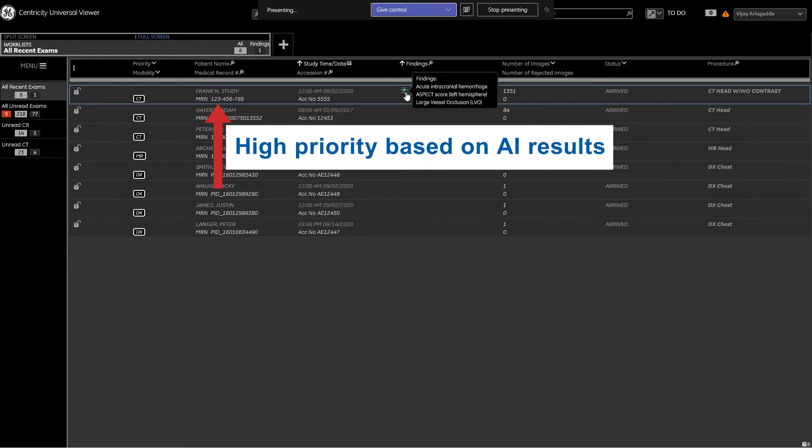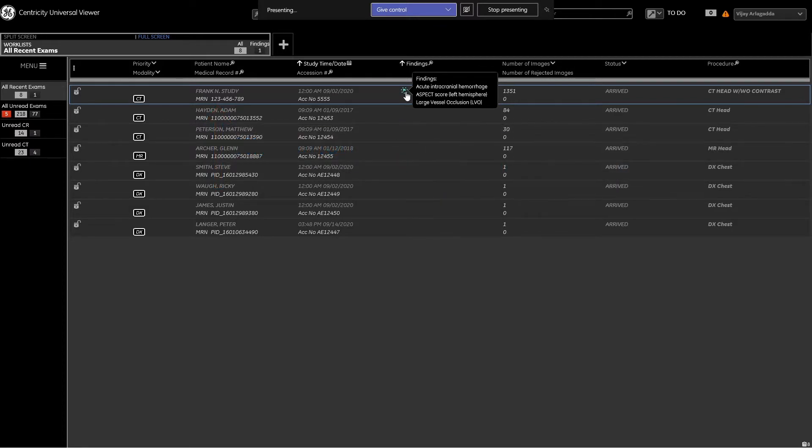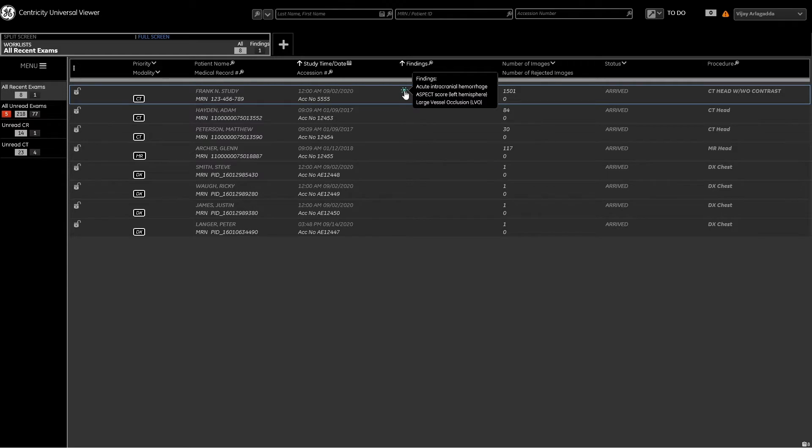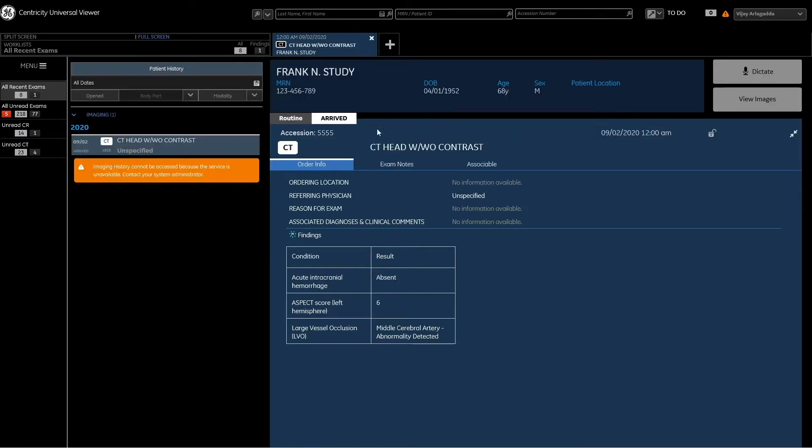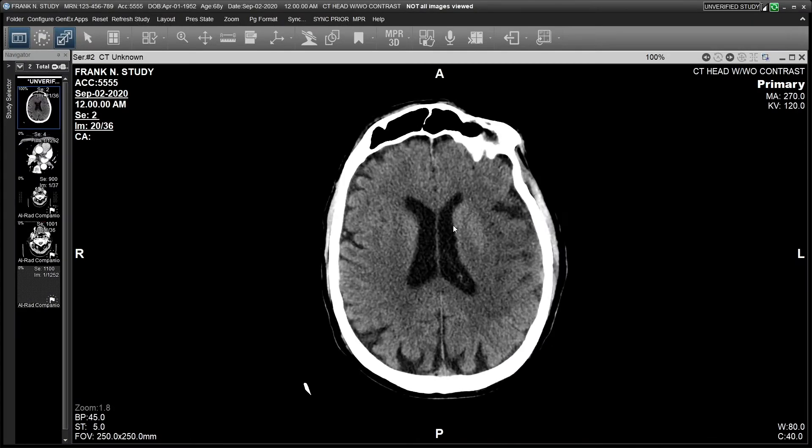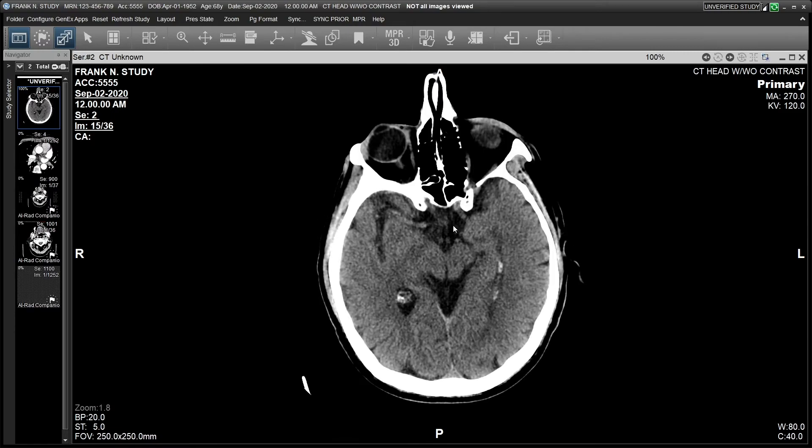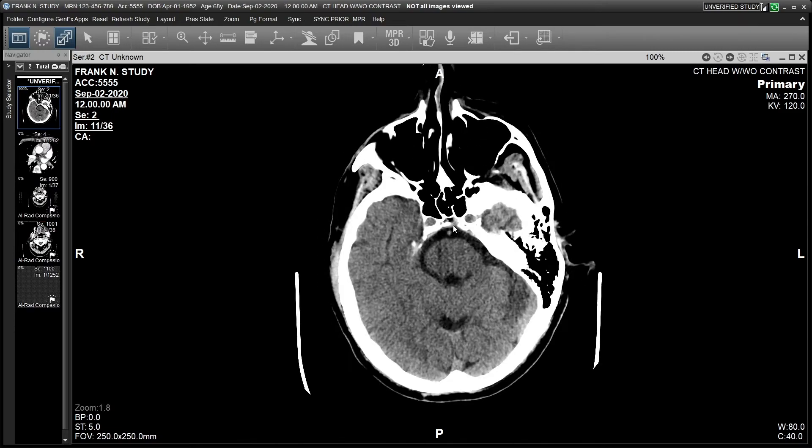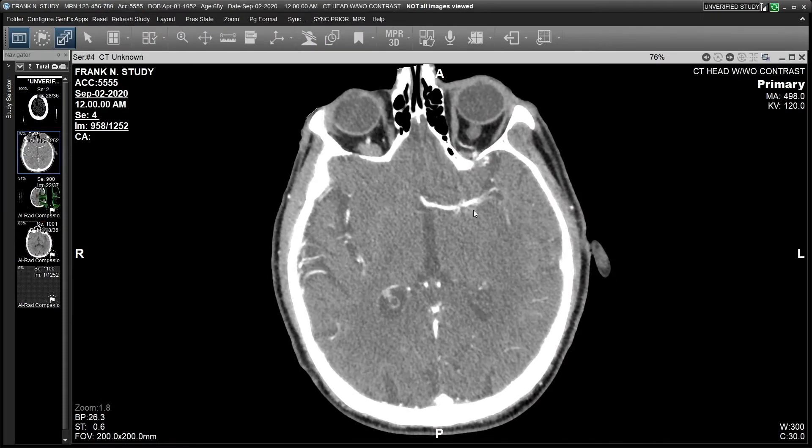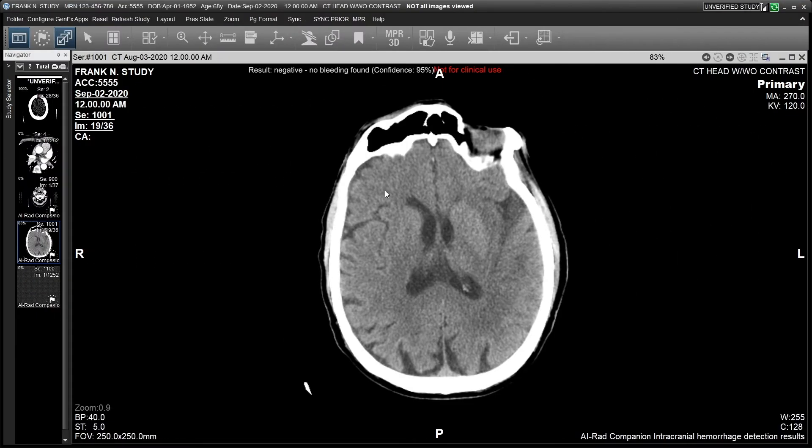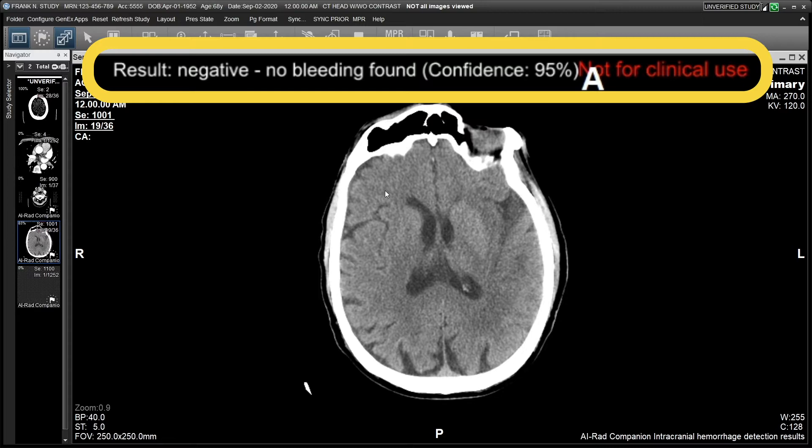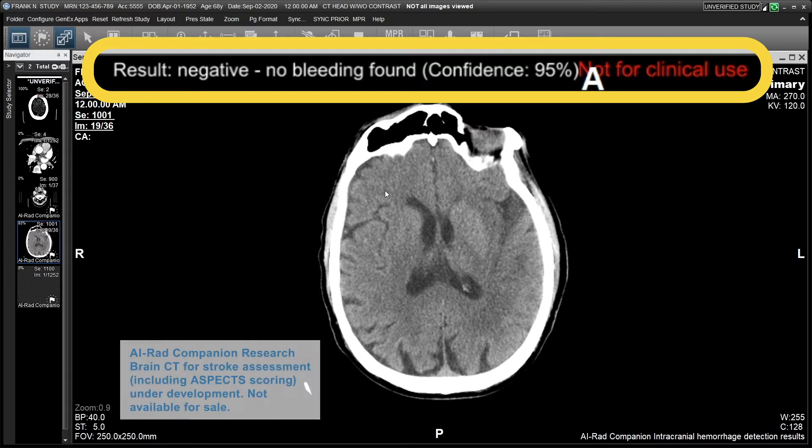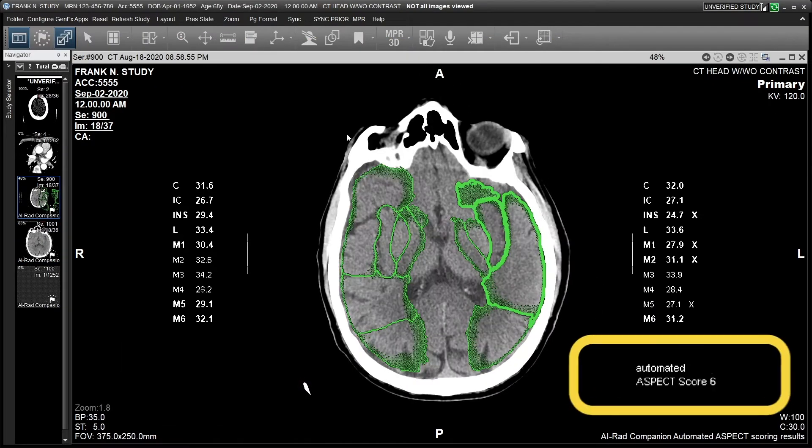Based on the acute results, this exam is moved to the highest priority on the reading work list. The radiologist notices that our CT head and CTA head and neck study has been flagged on the work list. Hovering over the flag icon on the GE Centricity PACS reading work list, the radiologist sees the message indicating pertinent findings. To avoid bias, the radiologist first reviews the study themselves. On the non-contrast head CT, the radiologist does not identify hemorrhage and determines an ASPECT score of 9. When reviewing the CTA, the radiologist identifies a large vessel occlusion in the left MCA. The radiologist next displays the detailed AI results from the Siemens Healthineers AI-RAD companion for confirmation. The radiologist notes that the study was appropriately prioritized on the work list, optimizing report time for this time-sensitive diagnosis.